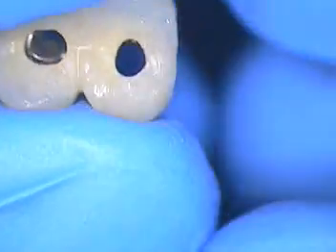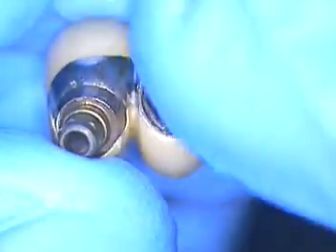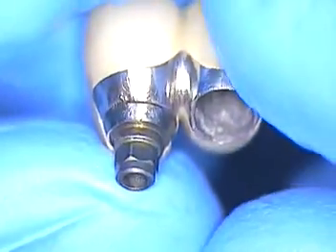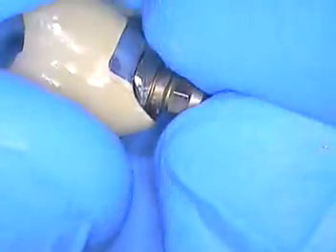Hello, welcome. We're back. I'm looking right down at the two units now, all cleaned up. We were able to retrieve one of the abutments. The other one is still cemented thoroughly within the prosthesis.